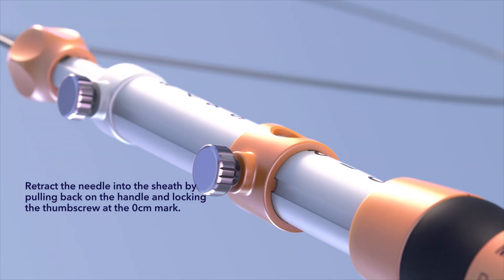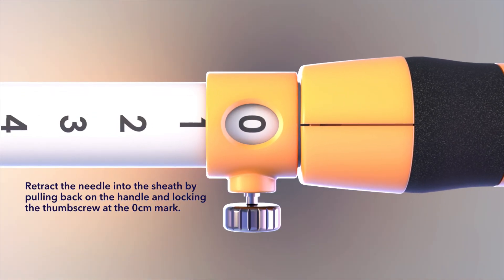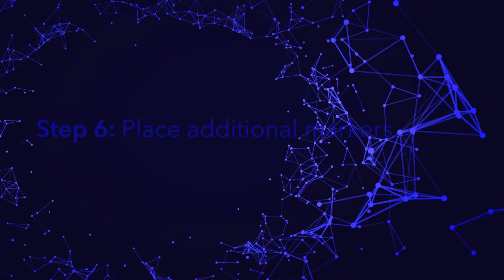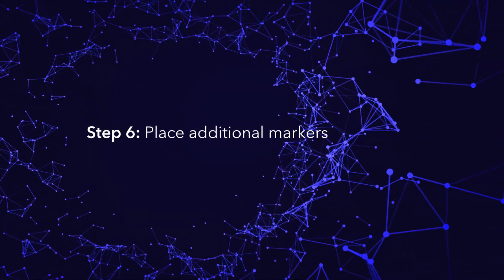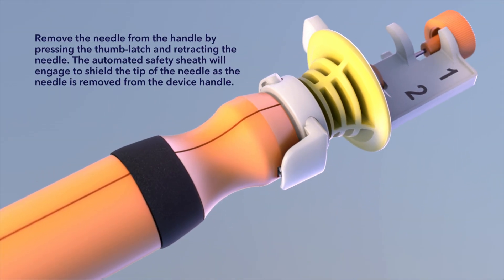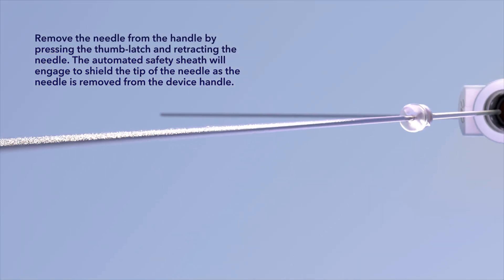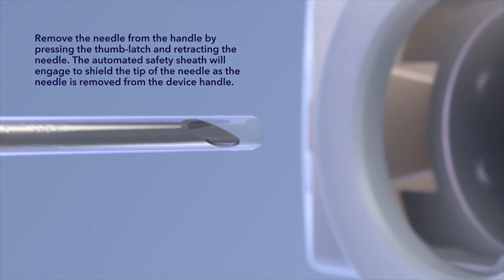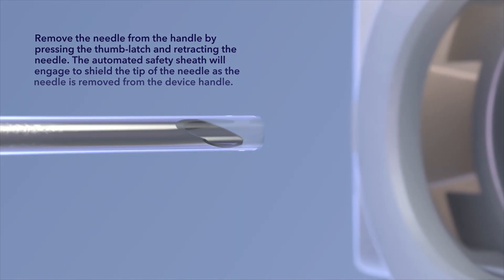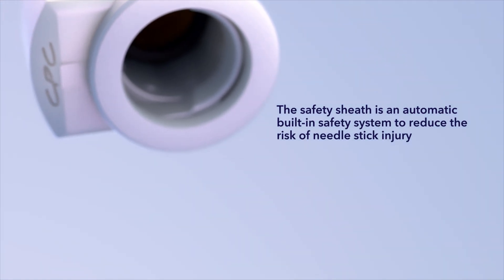Retract the needle into the sheath by pulling back on the handle and locking the thumb screw at the 0 cm mark. Remove the needle from the handle by pressing the thumb latch and retracting the needle. The automated safety sheath will engage to shield the tip of the needle as it is removed from the device handle.